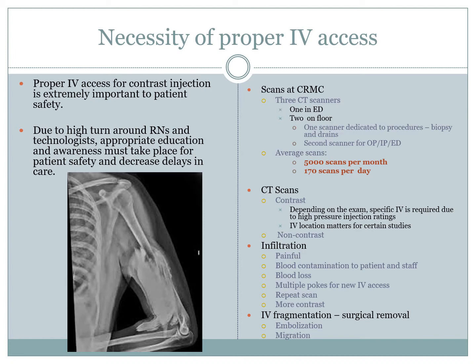Because some of these scans, for instance, a CT angio or an embolism or anything like that that we need to see promptly, an IV access is something that can delay the process, and we don't want that when it's an emergent exam. So proper IV access is necessary to expedite the care for patients.